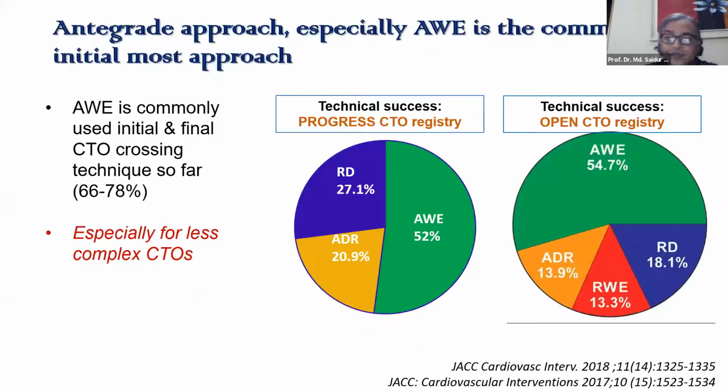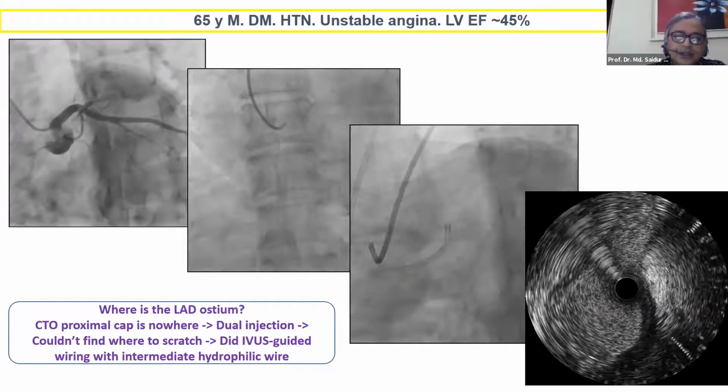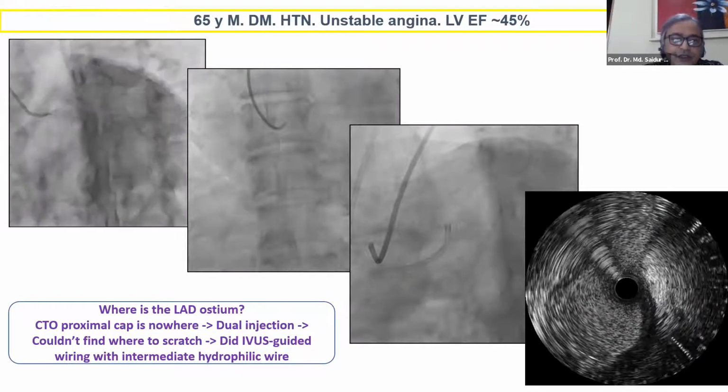I love the antegrade approach because, as Arun also said, it has fewer complications. That's why the most common approach in the world is still the antegrade approach, especially antegrade wire escalation. So before going deeper in the talk, I want to share a case.